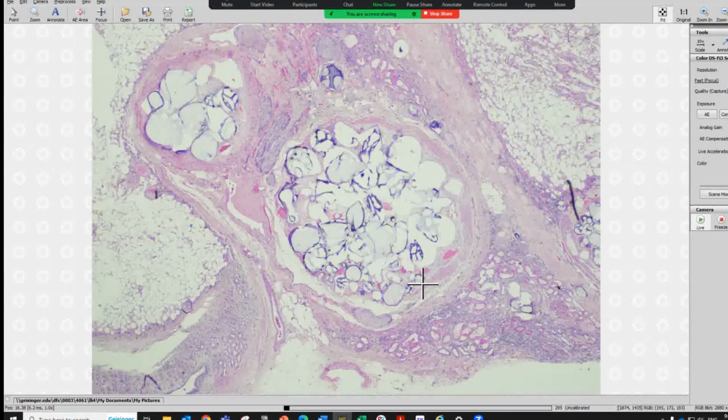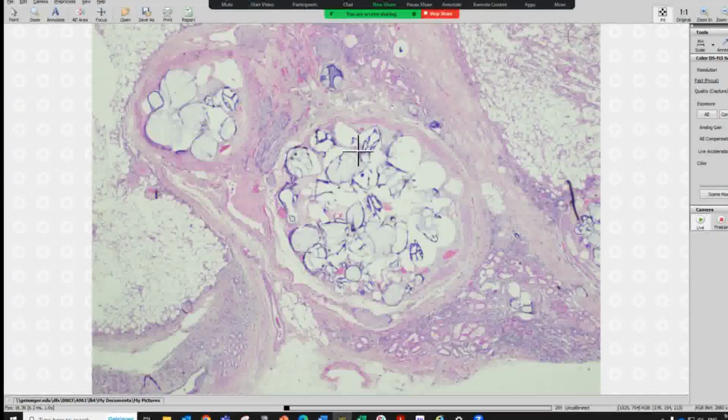This is gel foam. If you're interested in derm path, you see this because some surgeons will use gel foam when they do shave biopsy, maybe some punch biopsy. If there is bleeding, they will use this kind of material to try to stop the bleeding. But this time, I think the interventional physician just used gel foam to embolize this tumor because of bleeding.